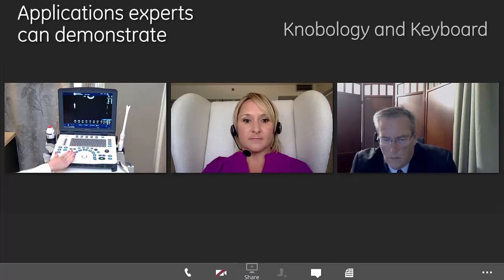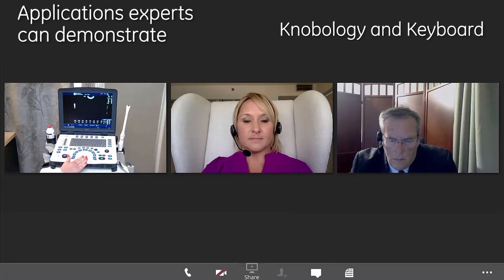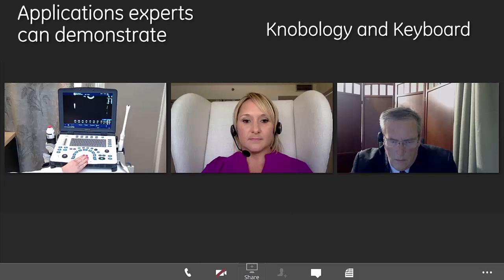There is one probe port on the system and with that it's very easy to change your transducers out. There's a lever that you pop down, you'll pull the transducer out, put another one in and pull that lever back up again, and that's located right over there. What you'll notice with the system is there's a trackball, and the most commonly used functions are going to be located right around that trackball. That keeps your hand in one place and helps to minimize your movements and maximize your workflow.